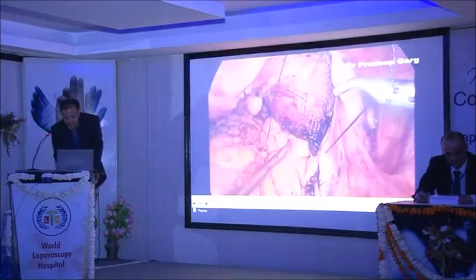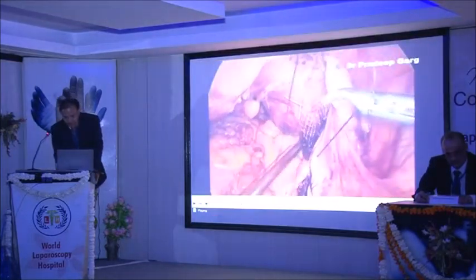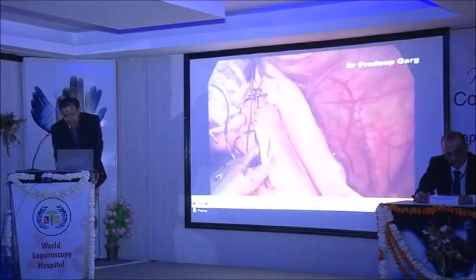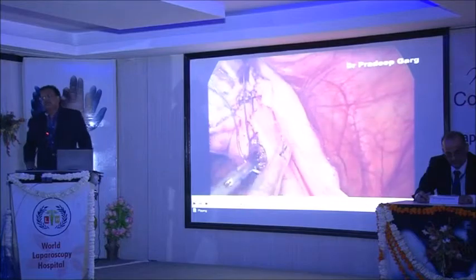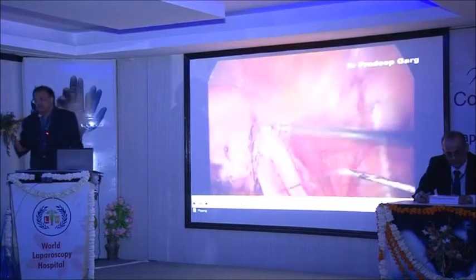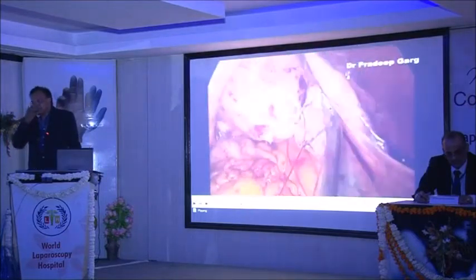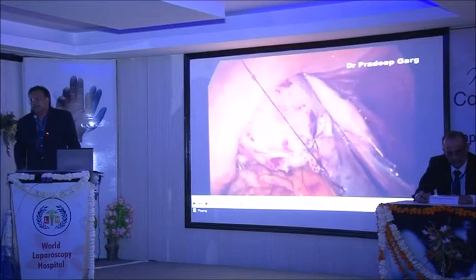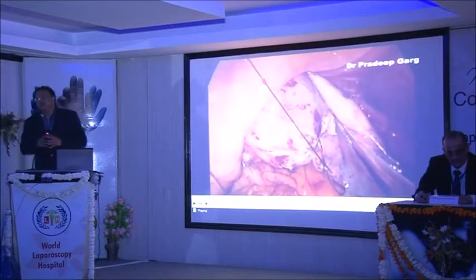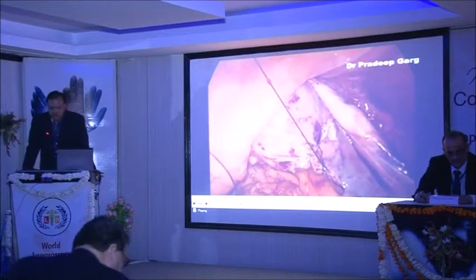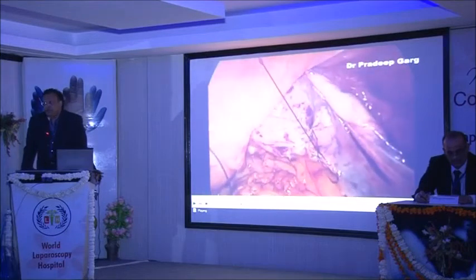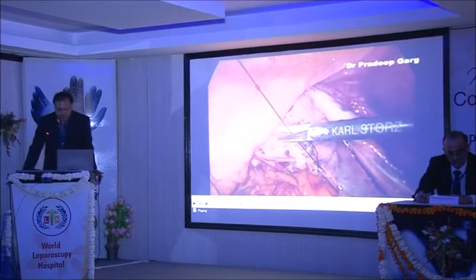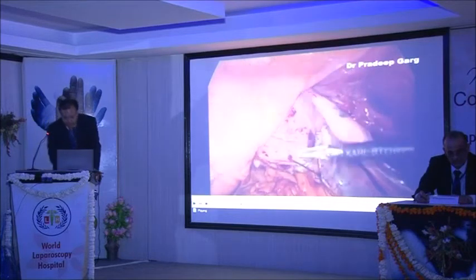You can see that this mesh — basically, what we are doing is retroperitonealization of the mesh. Because I don't want to leave the mesh inside the abdominal cavity, so that it can invite the bowel and cause small intestinal obstruction. So it is better to nicely cover the mesh with the help of peritoneum. I always keep an eye on the right ureter. This is the final picture of the mesh.